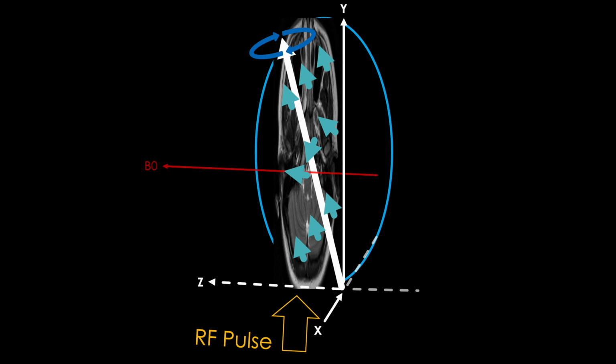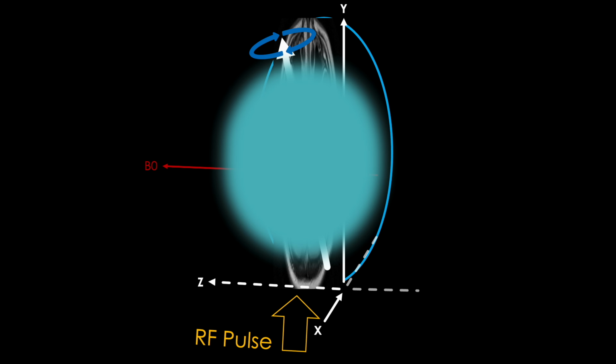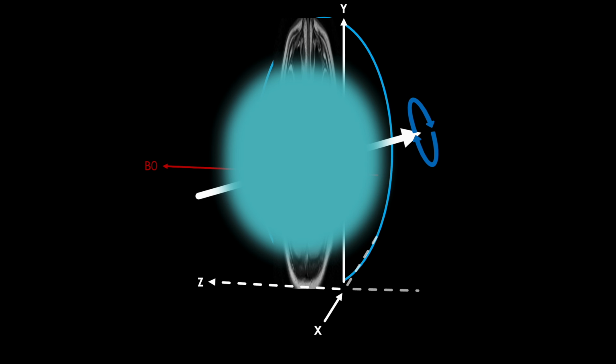And while we used the simplified example of a few voxels and net magnetizations to highlight how this works, the reality is we're dealing with over 1 trillion hydrogen protons on a quantum scale, and it's not as pretty as portrayed. And really, our RF pulse is inverting a statistically significant amount of these spins into the other half of the XY plane, allowing us to recover some of that dephasing that's occurred and generate our echo.